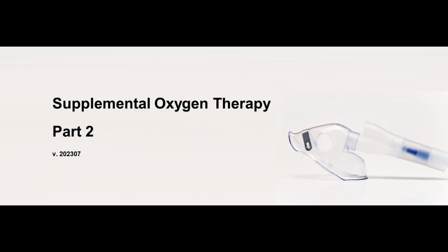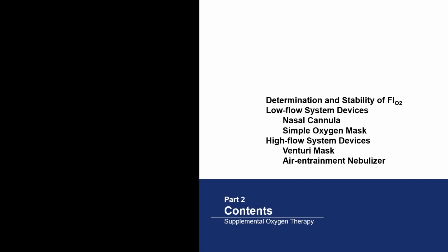This is the second part of our supplemental oxygen therapy, which covered FiO2 determination and stability in low and high flow systems. Low flow system devices such as nasal cannula and simple oxygen mask, and high flow system devices such as Venturi mask and air-entrainment nebulizer.